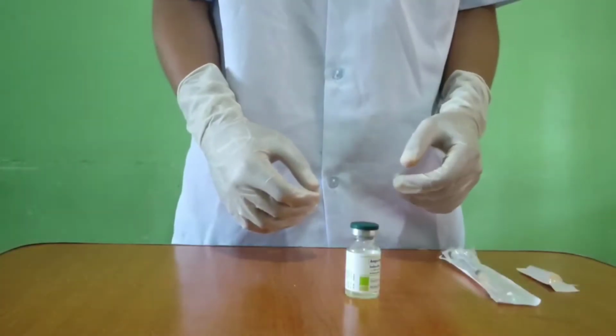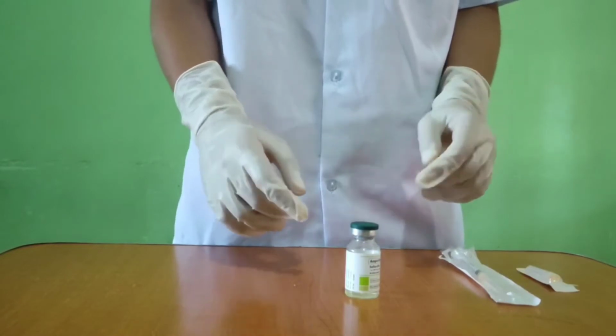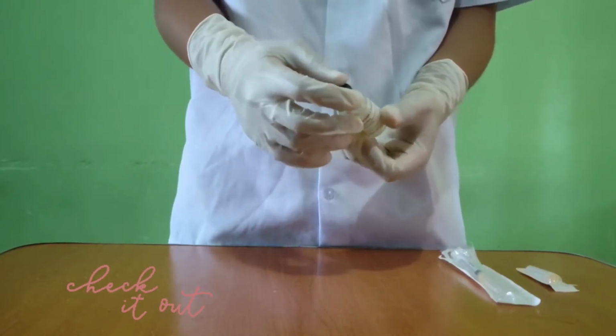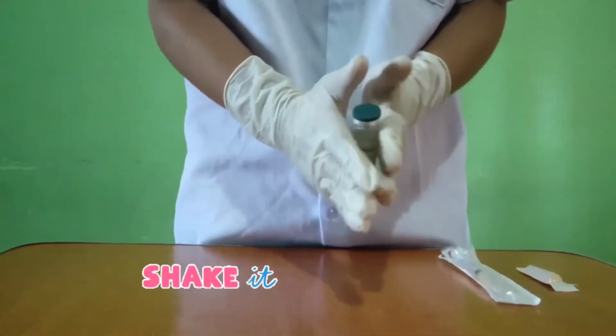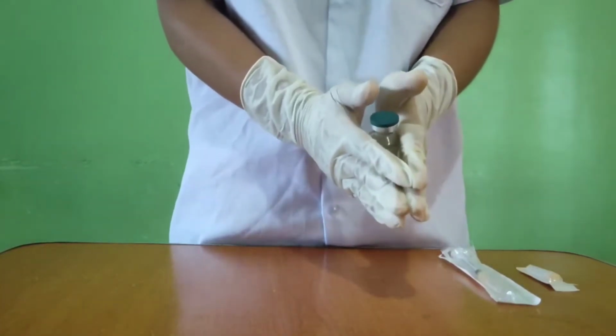Now, we are ready to draw up our ID injection. When we're dealing with the vial, always check the expiration date, the lot number, and the manufacturing date. Shake the vial gently and don't forget to explain the procedure to your patient.